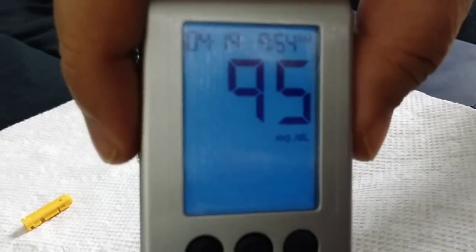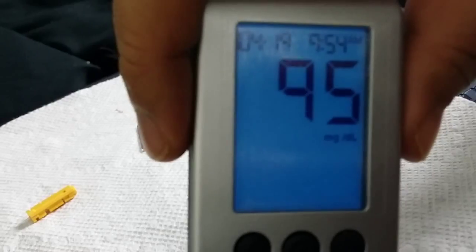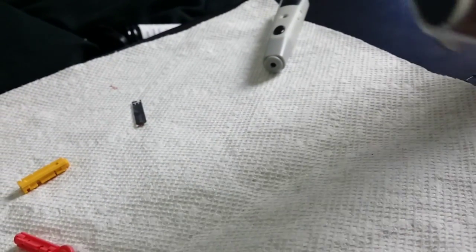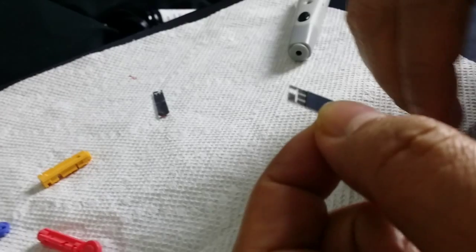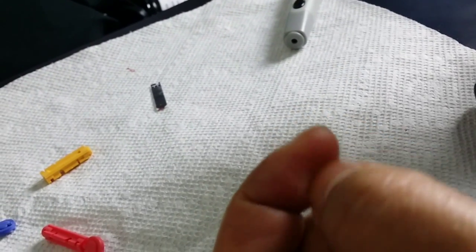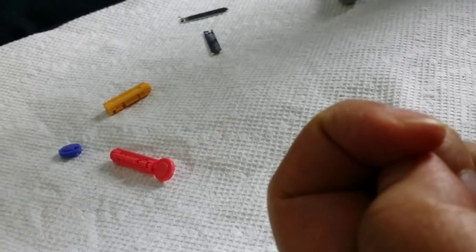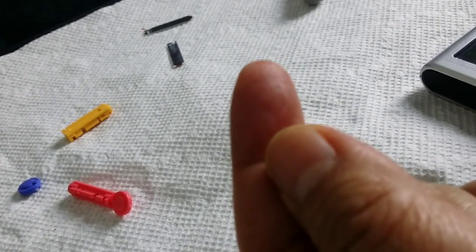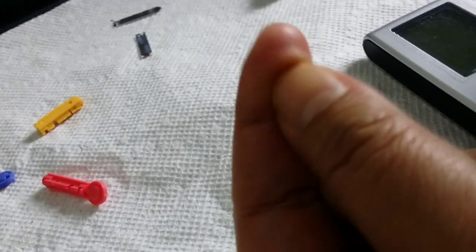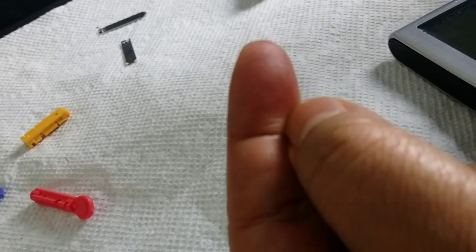It's 95. Today is April 19, 2014. 95 — so it's in the stable range. The stable range is from 75 to 130. Before eating is 75 to 100, and it's 9:44 a.m. and we haven't eaten yet. So that's cool — it's in the stable range.